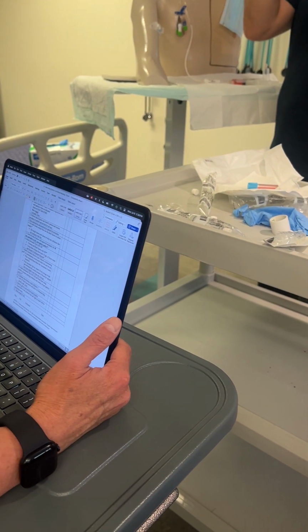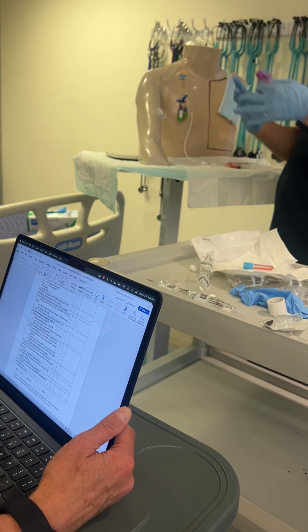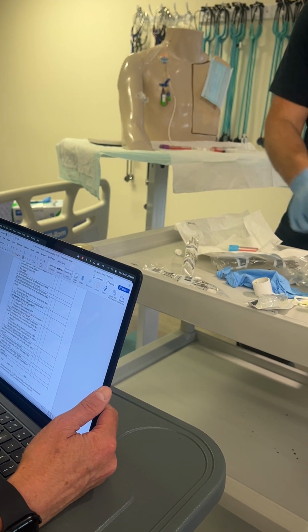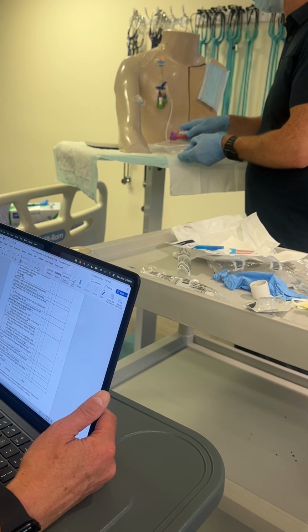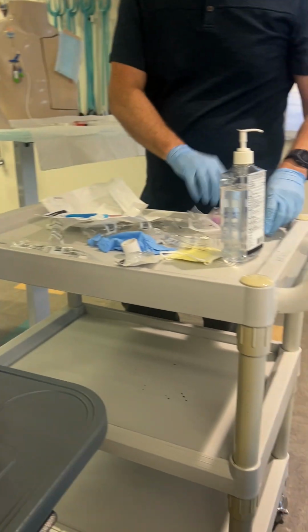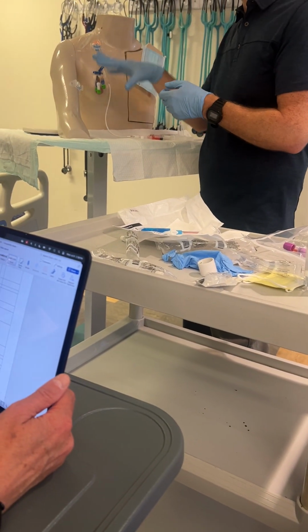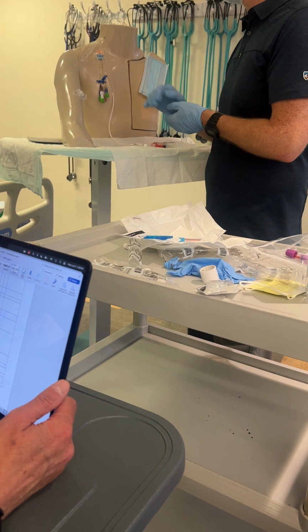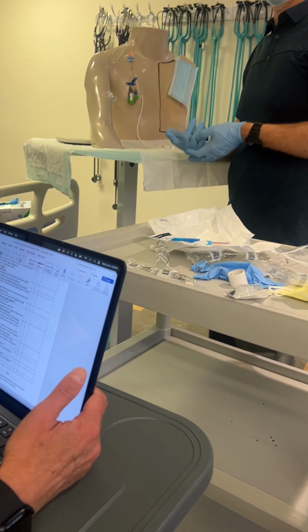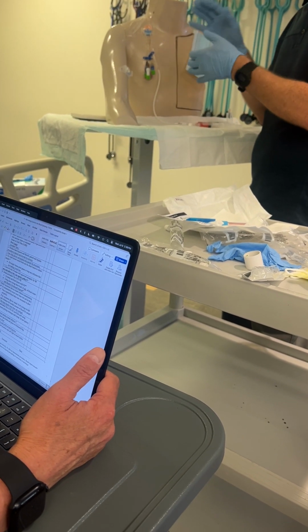So now we've got our tubes, right? So we need to label. Initial and patient labels, date and time, right? Then we get our bio bag. The biohazard bag, we seal it. And then we would document, we cleaned the dressing, right? Or we did the sterile dressing change. We replaced the caps, right? Drew the blood and sent it. And then asked if the patient needs anything, right?